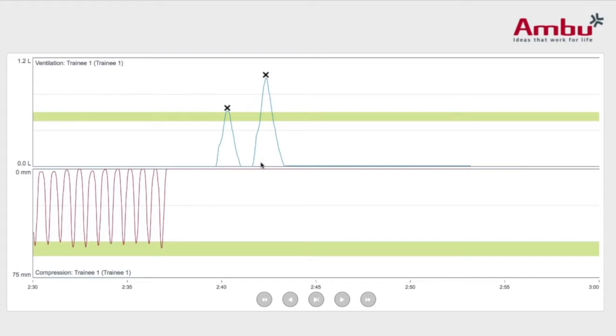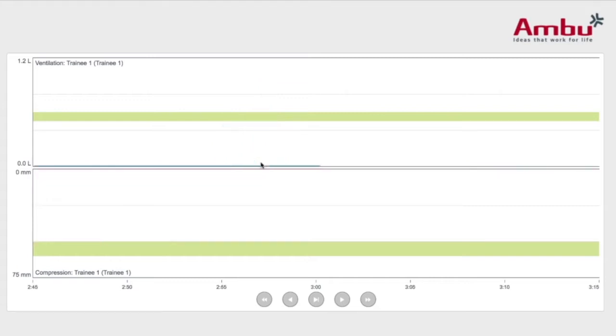On your compressions, you want to get compression depth on the green line. You want to have full recoil, so when your rebound curve doesn't get to the top of the line, you didn't fully recoil.